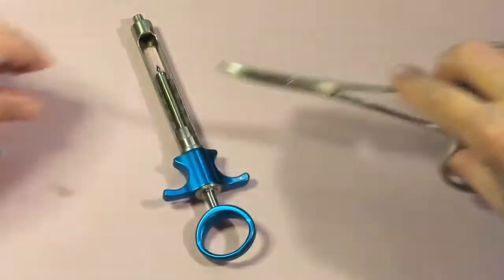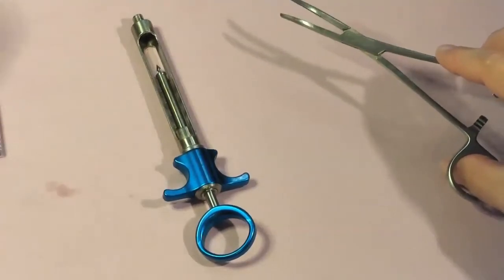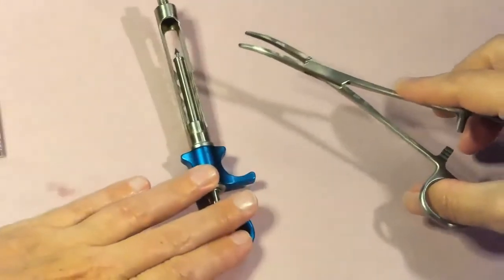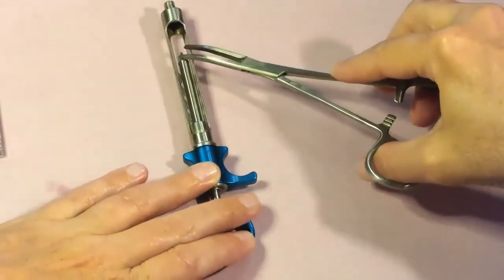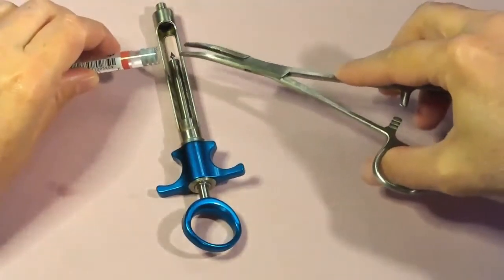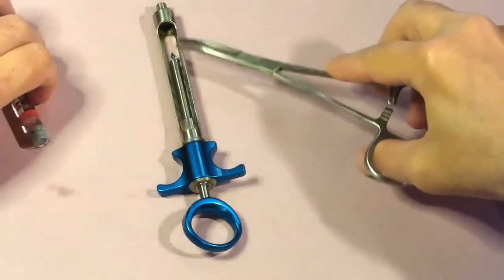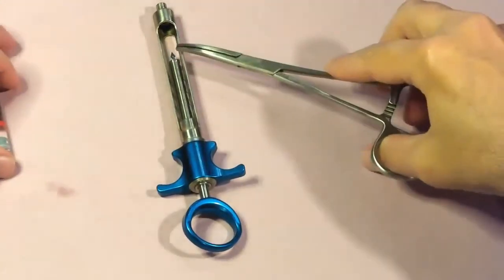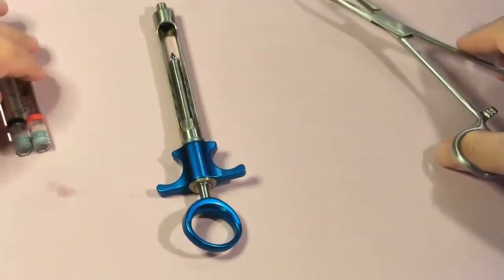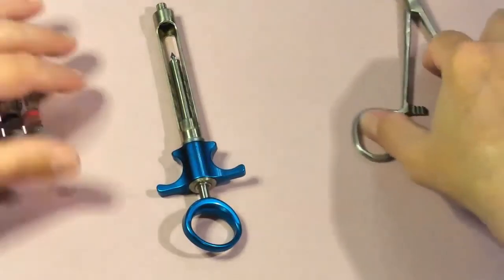We want the hemostat open and in a position that's readily available to grab in case of an emergency — on our anesthetic tray with the rest of our anesthetic items. We do use the hemostat for a few other things in anesthesia: we can use it to remove our needle, help with needle recapping, and also to help remove a rubber stopper from the harpoon.